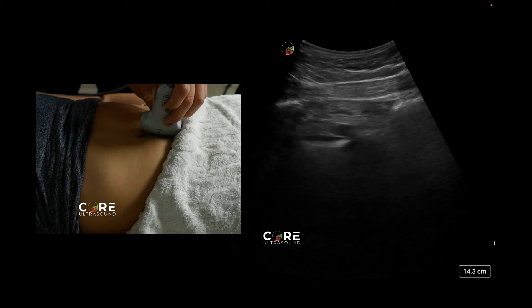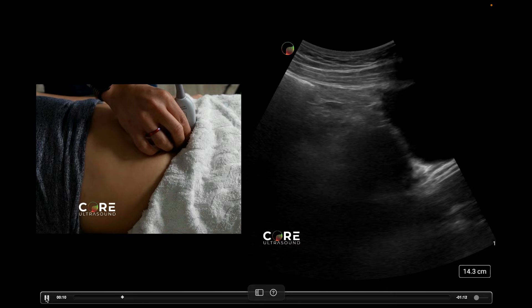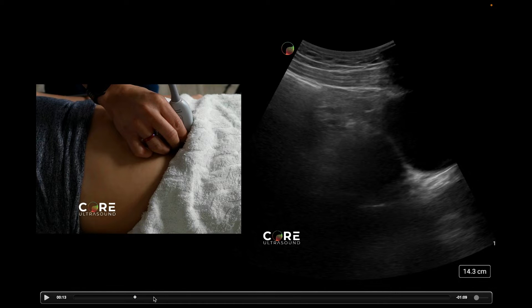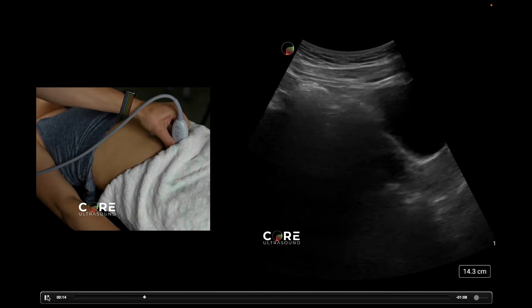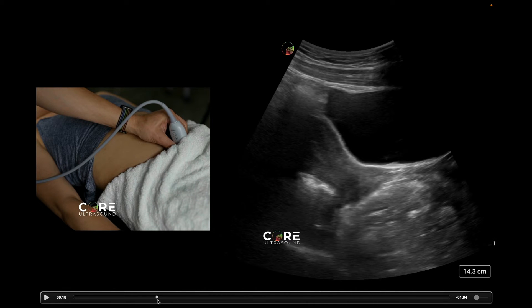I often start, especially when looking at pregnant patients, with the transducer in the sagittal orientation. The first landmark I'm looking at is the bladder, and I'm seeing a uterus here along with some intestines. Notice I can't see the uterus all that well, so I'm moving the transducer a little bit more inferiorly to place that bladder more in the center, so the sound beam can go through the bladder with no attenuation and reflection from bowel to actually reach the uterus more efficiently.